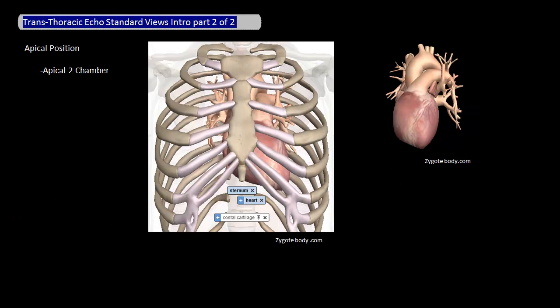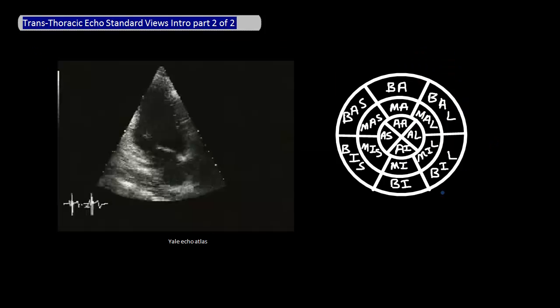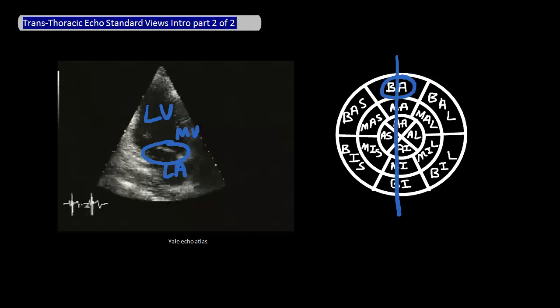The seventh view is the apical two-chamber view, which is also at the apical position. The cut across the heart in this view is best seen from the lateral view, and your goal is to visualize the left ventricle and the left atrium. Here's an echo of this view. Since you're at the apical position, the ventricle is going to be up top, and since this view looks at the left side of the heart, this will be the left ventricle, and the left atrium will be here. The mitral valve will be seen in between. The angle of the cut means you are visualizing these six parts of the left ventricle.